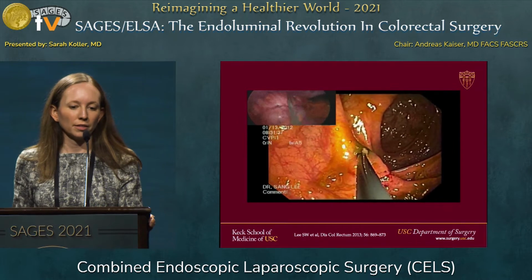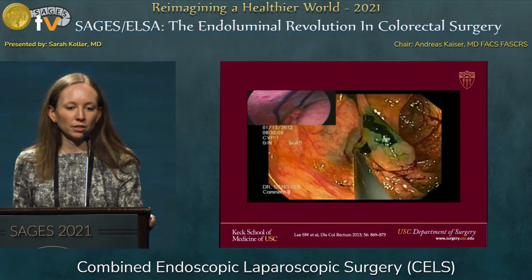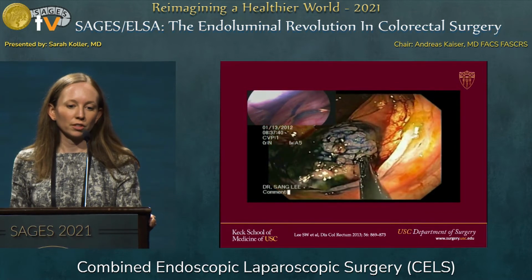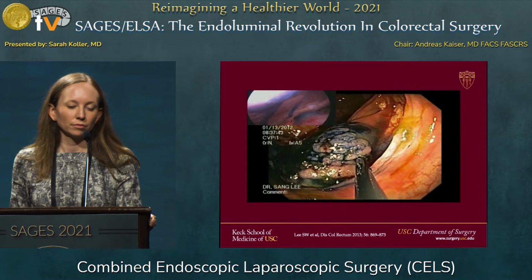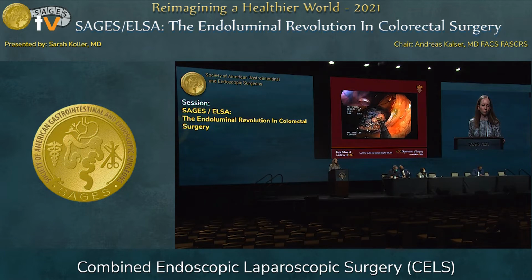After the colon is mobilized, the polyp is lifted, and through the laparoscopic view in the left upper hand corner, you can see the lifting material externally on the serosal surface of the colon as well. So after the polyp is adequately lifted, a laparoscopic bowel grasper is used to invaginate the colon wall, so that a hot snare can be used to resect it endoscopically in a piecemeal fashion. This is done with several passes of the hot snare, and each time the colon wall is invaginated with the bowel grasper.